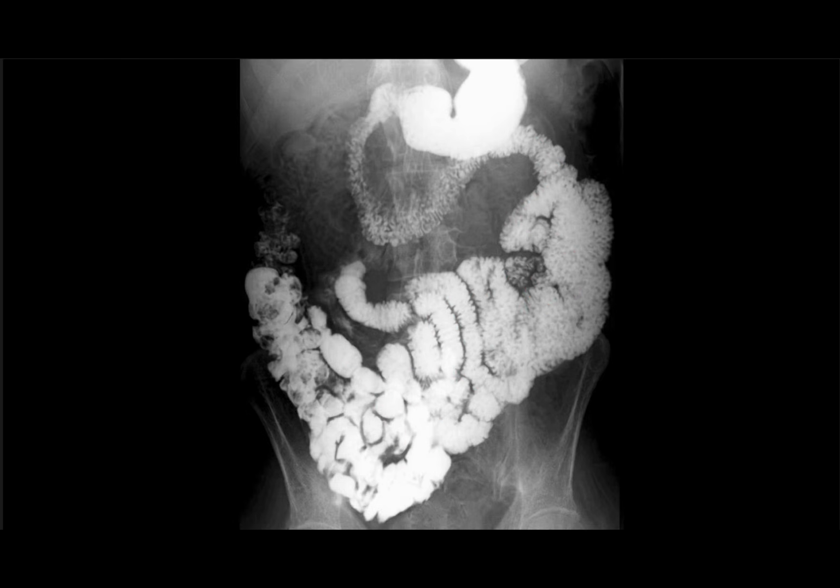Now, to help you to easily differentiate the jejunum from the ileum, if you remember from anatomy, the jejunum has very, very prominent mucosal folds. So because of those prominent mucosal folds, the walls of the jejunum appear feathery in a radiograph. Now check this out. This is the jejunum. If you look at it very well, you see how the walls are feathery. So this is the jejunum.